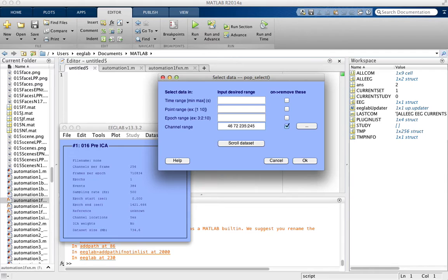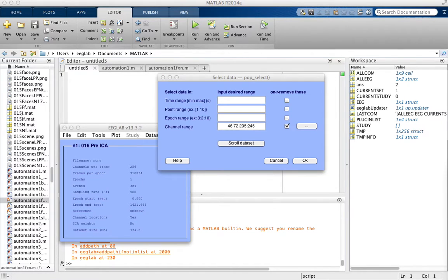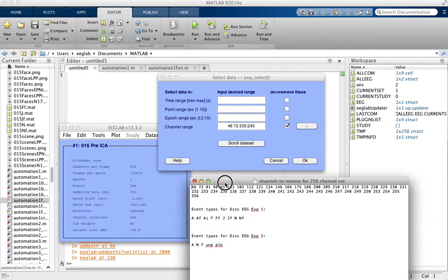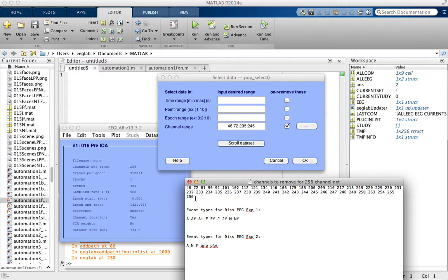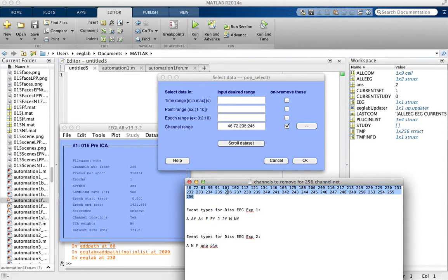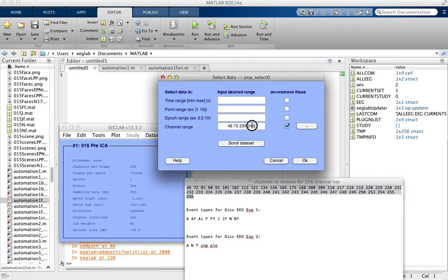Also, we have a text file on the computers that's called Channels to Remove for the 256 ChannelNet. It's just a .txt file. And it has this is the list of channels that we want to remove. And you can just copy and paste that right into there.